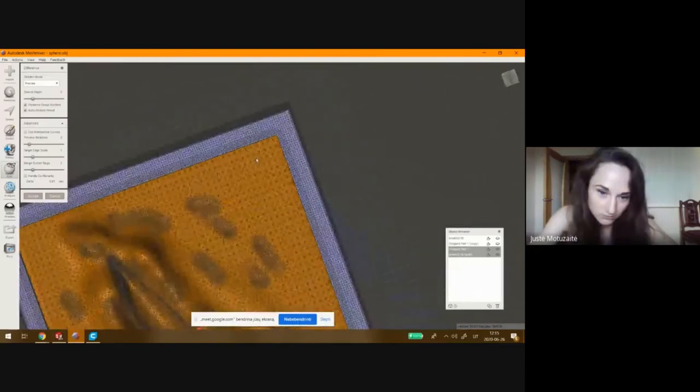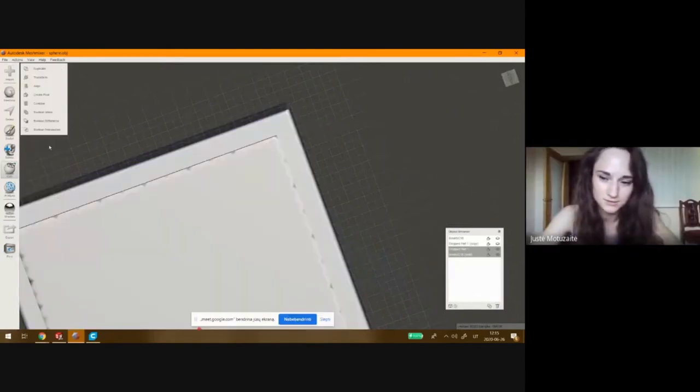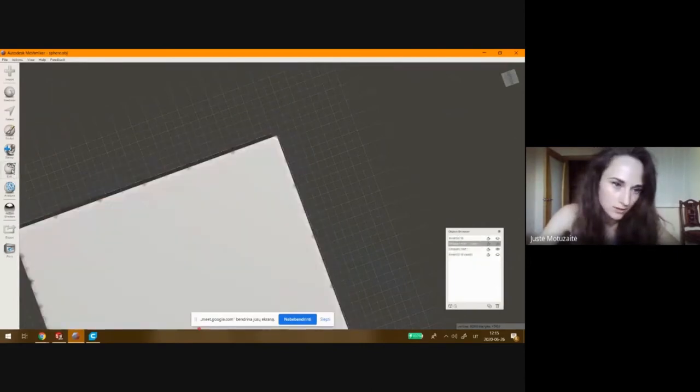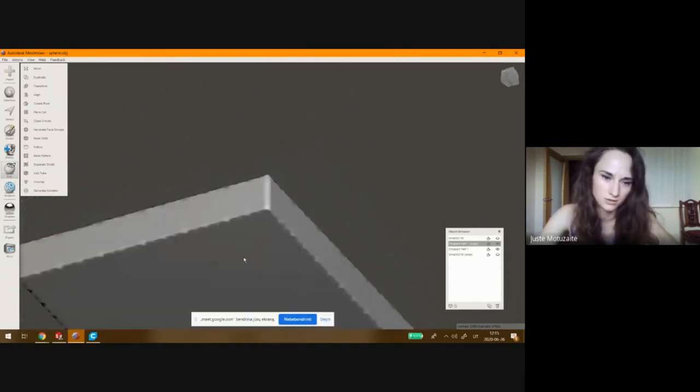Does seem so. When do you solidify? Yeah, you solidify. Wait. It's already solid. Here. It's edit, and then you make solid, and then you do the Boolean difference. And it should, I think, correct all these things. Yeah, Solidify is an amazing tool. It helps to fix a lot of defects. You should have a sharp edge preserve in the options, and usually that helps to get a better border.